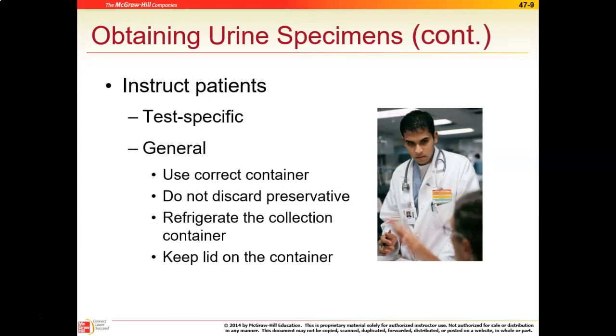A couple of other things too. Some things, we have to make sure we use the correct container. Some of these can use the same container. Other things need a specific container. So once again, we need to know what we're doing so that we can give the appropriate container.